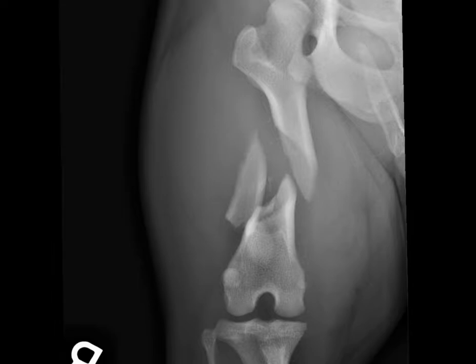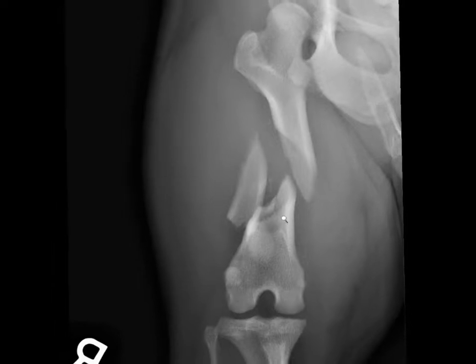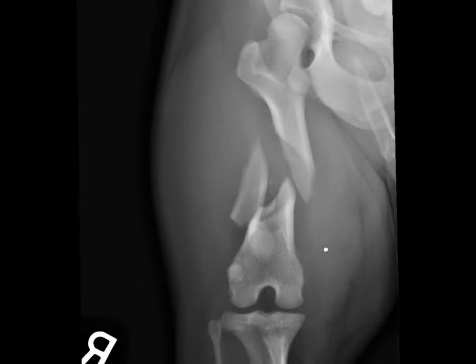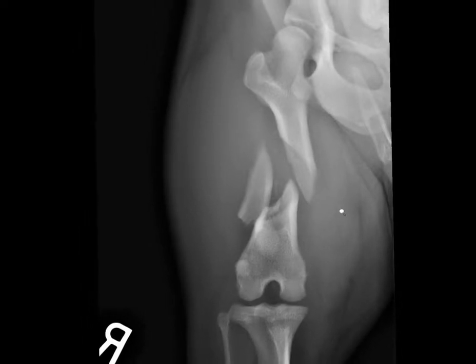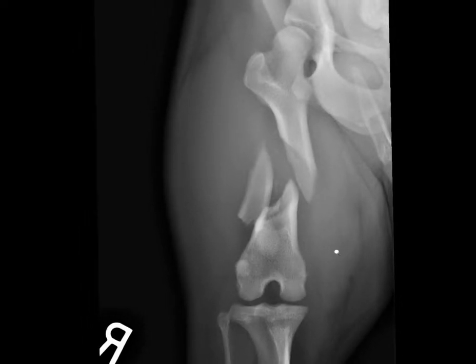Today's example is a one-year-old French bulldog recently hit by a car. You notice during your physical examination that there's pain of the right hind limb. Once the patient is stabilized and analgesia has been provided, you safely perform two views of the right femur area.